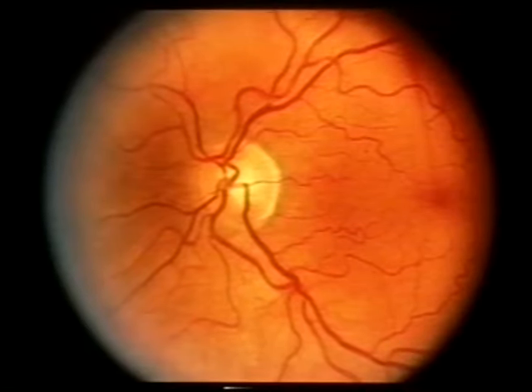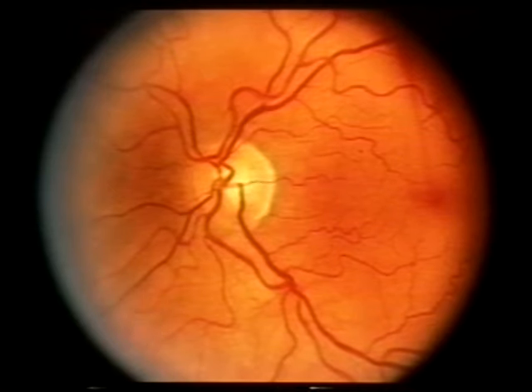Here's a normal retina. Your view will include only a small section of this picture. Find a blood vessel and then follow it centrally until you can see the optic nerve. Look closely at the nerve and study its color, the clarity of its margin, and the size of its cup. The cup is the small yellow depression in the center of the nerve.